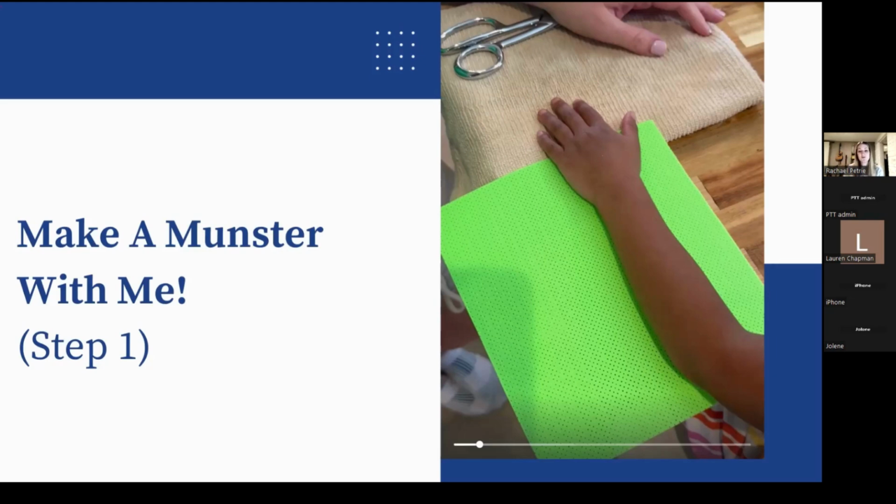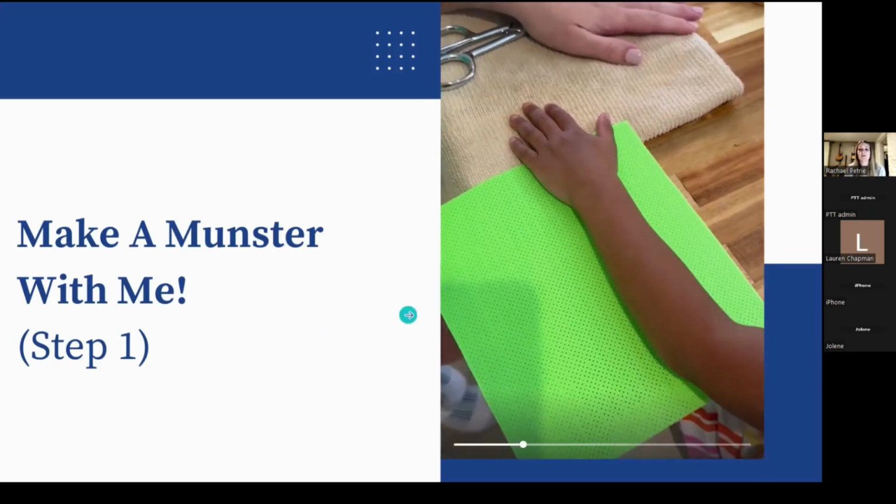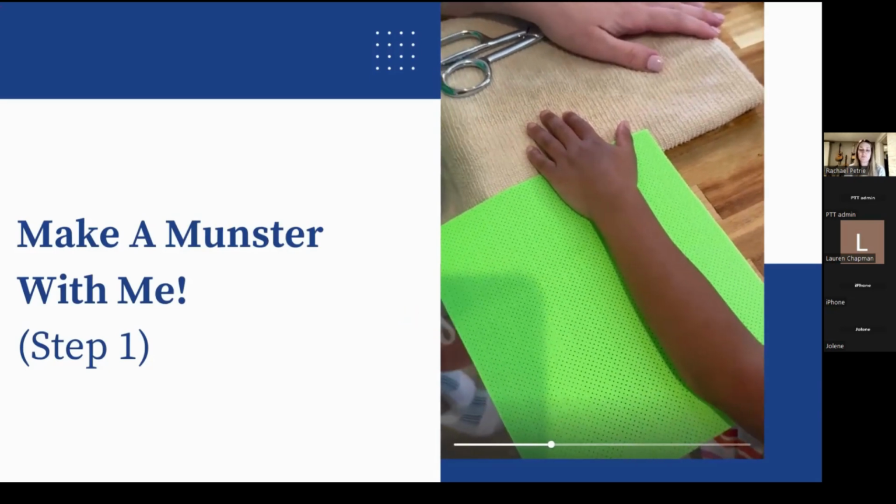It allows for elbow flexion and extension, but keeps the wrist, if you would like it to, and forearm in the correct position. You can extend it out to the fingers if you want to, but this one is just going to include the wrist. The audio is a little bit quiet, so I'll probably just talk through it. So she chose green.